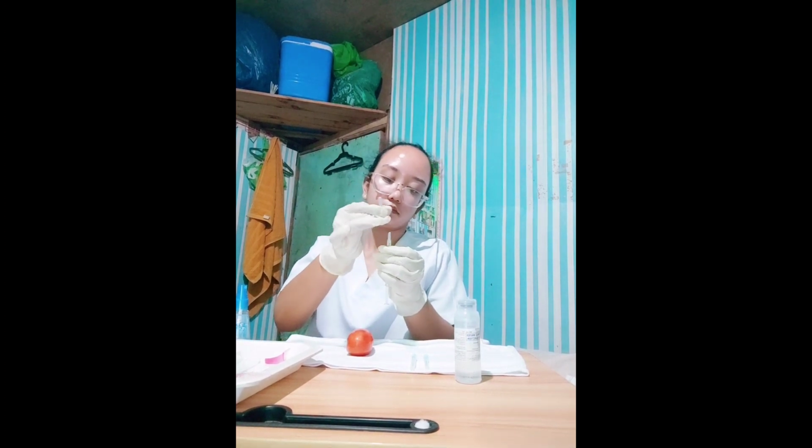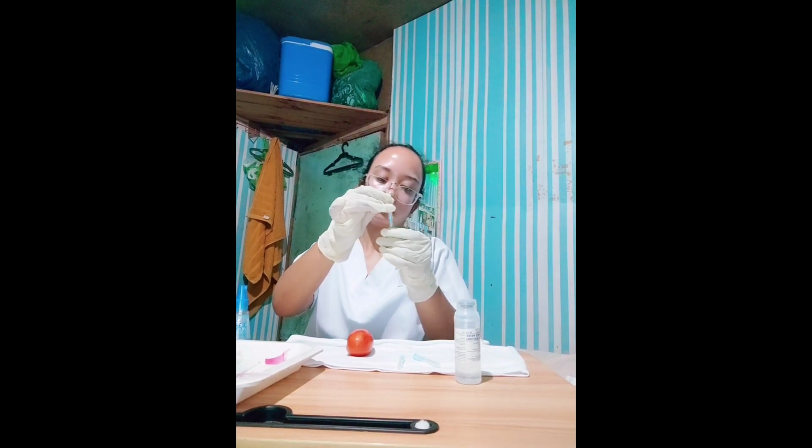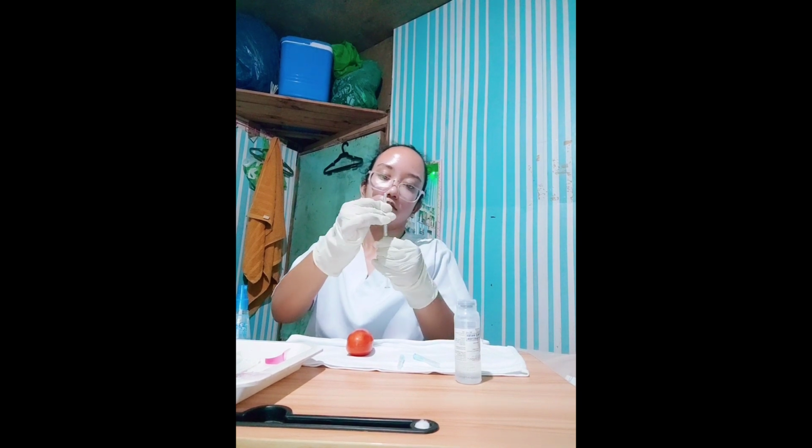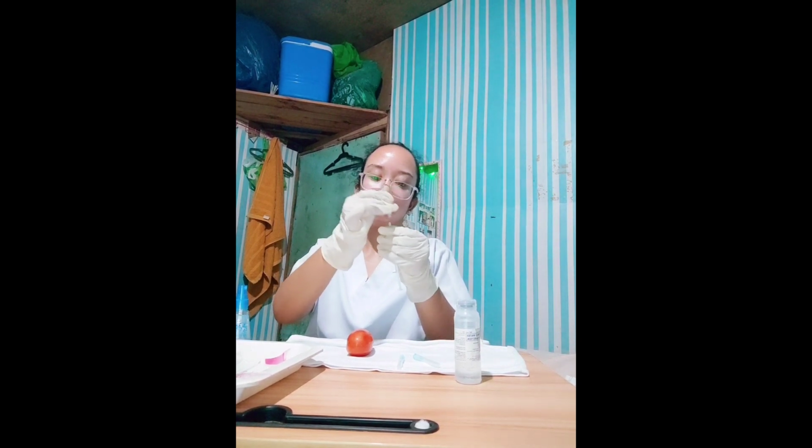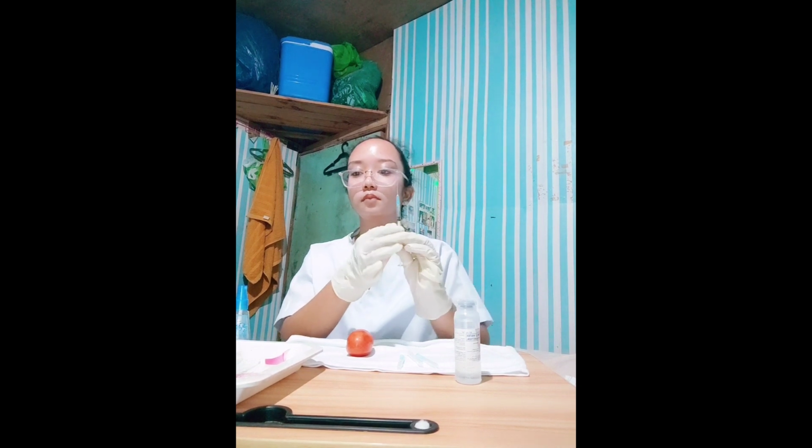So I will now change the needle. Now I will hold the syringe and release the skin to avoid injecting into compressed tissue.